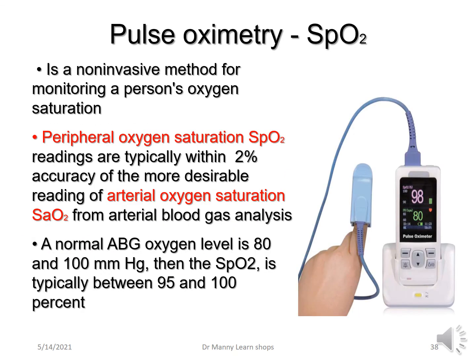Then you've got pulse oximetry, and we're going to focus on the saturation in particular. And pulse oximetry is a non-invasive method for monitoring a patient's or person's oxygen saturation and their pulse.